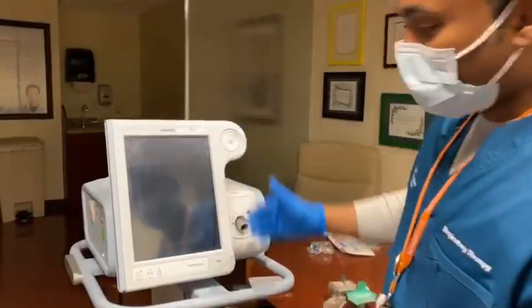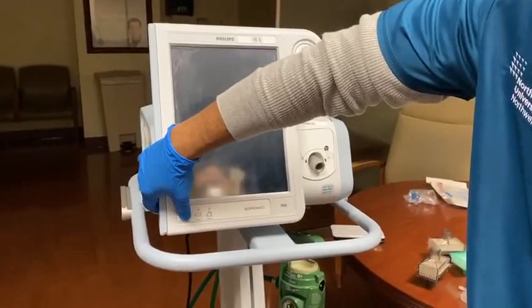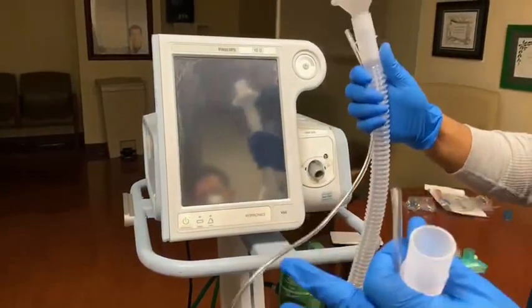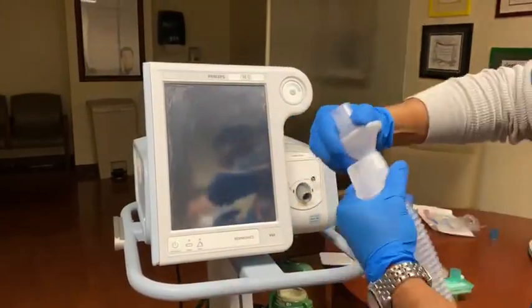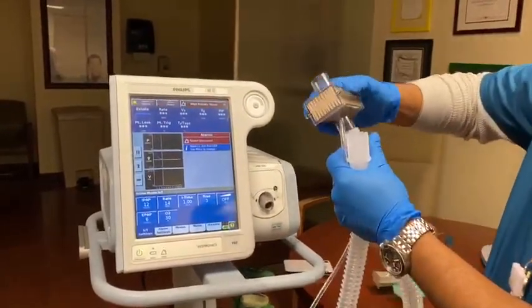Thank you. So this is the V60, your traditional non-invasive ventilator. We'll turn it on. We'll be using the traditional circuit. The first thing, we'll be changing the bacterial filter to a HEPA filter.